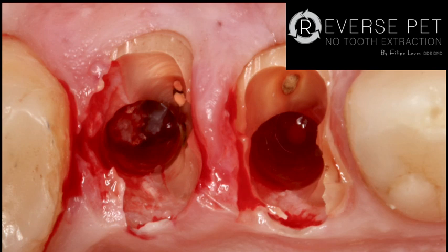You can even see the initial canals, the canals with the gutta percha over there on the buccal, and you can see on the palatal that we've already gone through tooth and bone. So our site is almost prepared.